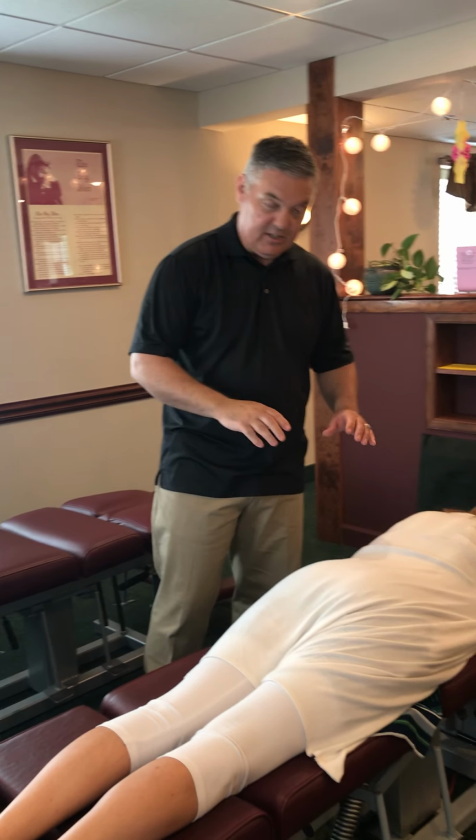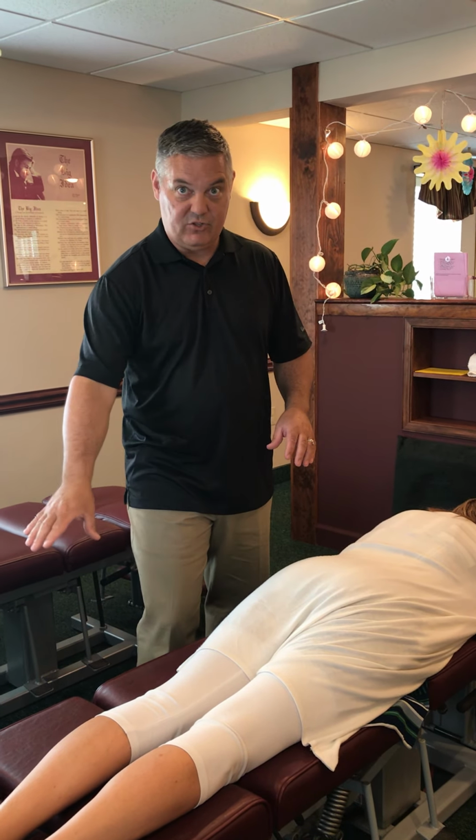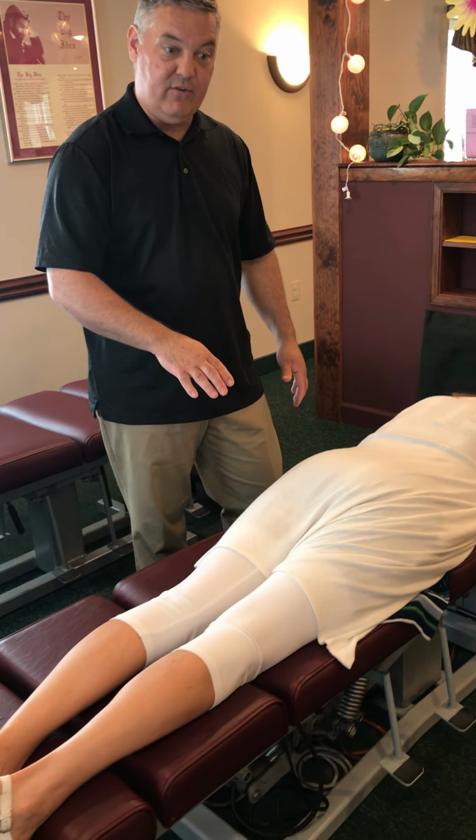So, adjusting style, a lot of what we do is mainly full spine diversified with a little bit of mirror image adjusting. We make use of the activator, flexion distraction, which we went through in a previous training video. So we're going to go through some of the vernacular and adjusting types. Number one is pelvis. So there's a couple different ways that we're going to adjust the pelvis.